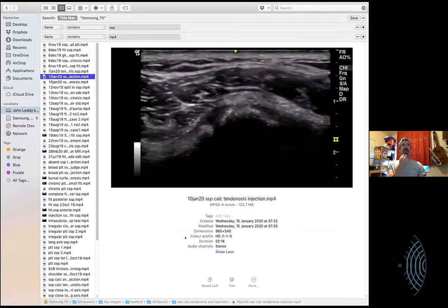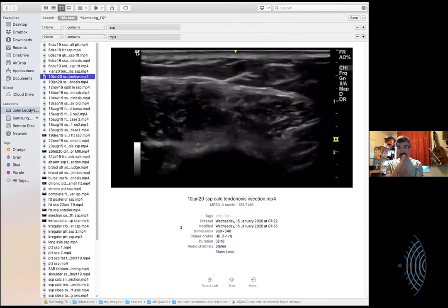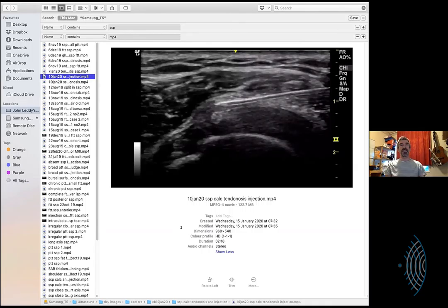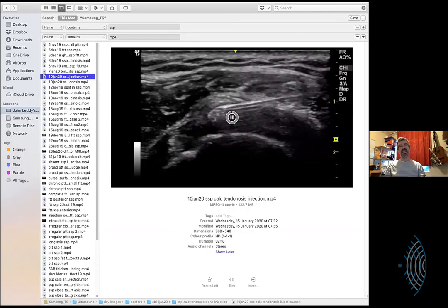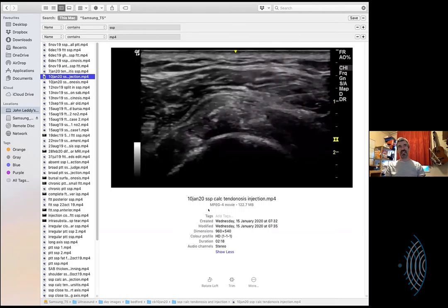And I want to see it flow this way, ideally, or perhaps that way. Wow. So you're having to differentiate through the fascial layer of the top of the bursa and not puncture the fascia surrounding the tendon. Well, frankly, I don't care. What I want to do is be in the true bursa, in that infinitesimally thin space, in some cases, that's there. And that isn't as easy as it seems.